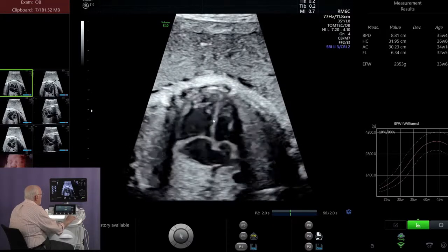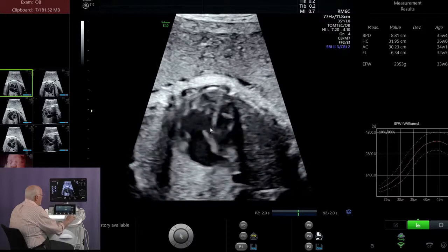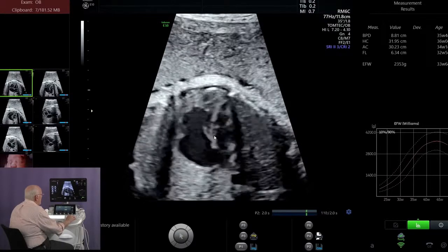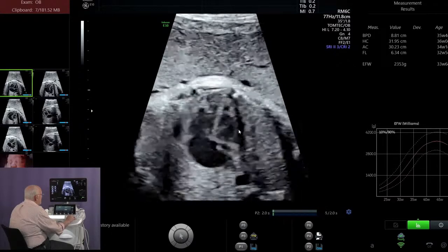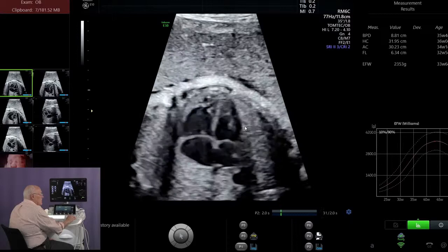This white echo is not the full thickness of the septum. It's actually a muscle band that's in the center of the septum. Because of lateral resolution, you're not picking up the full width of the septal wall. Also, we get some dropout of the left ventricular wall. So this is not ideal for our imaging acquisition for fetal HQ.